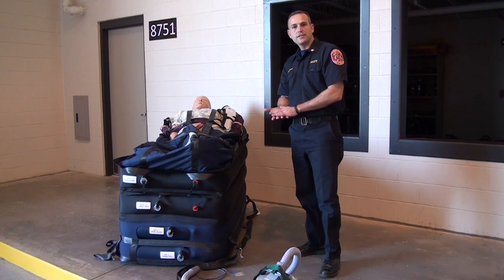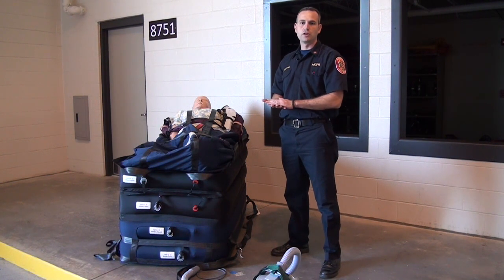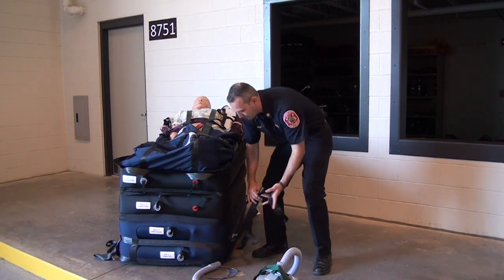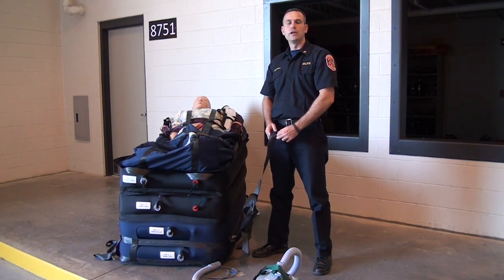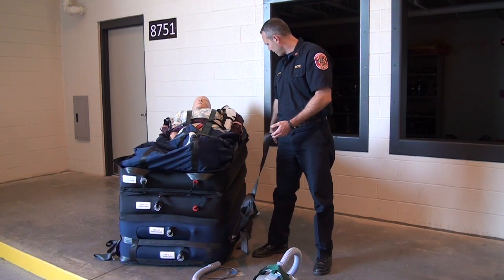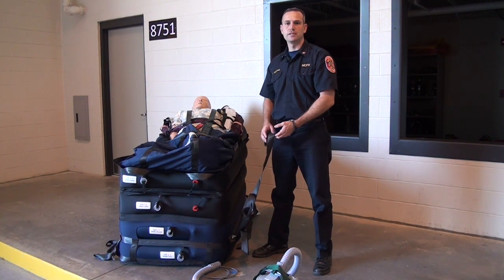It has a Teflon base so that we can move the patients across most surfaces that we come across. We have four carrying straps — one at each corner — to assist us in moving the patient once the hover jack is raised.